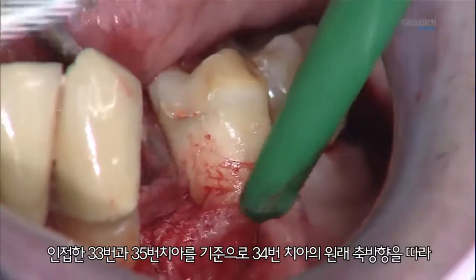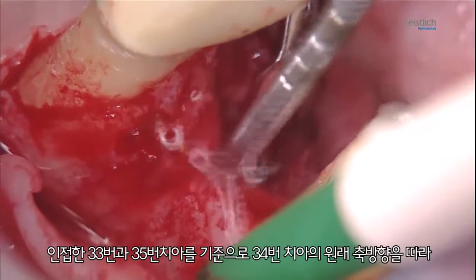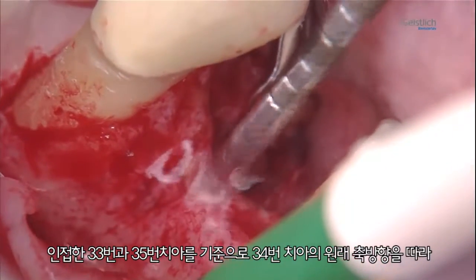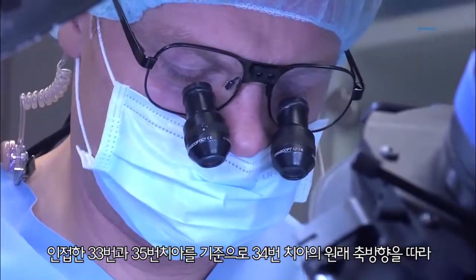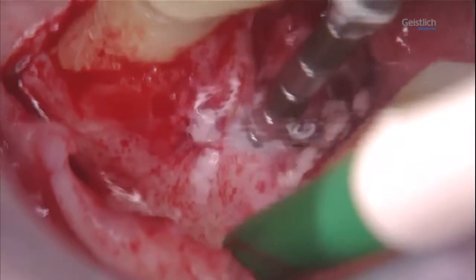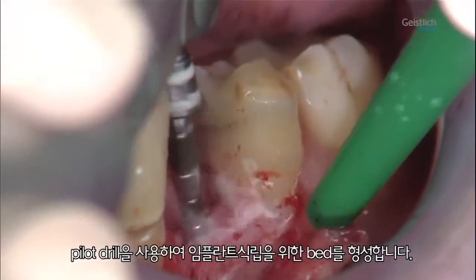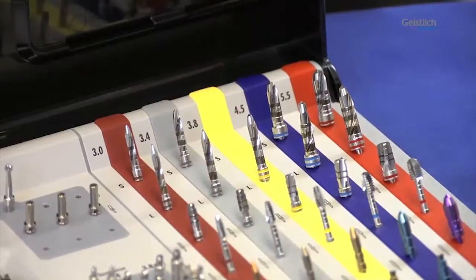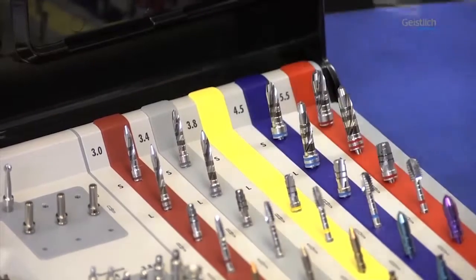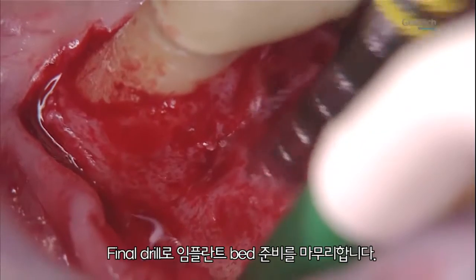We prepare the implant bed with a pilot drill under irrigation, following the axial direction of the original tooth 3-4, with the adjacent teeth 3-3 and 3-5 providing additional guidance. The pilot hole is now complete. We finalize the implant bed with a concluding round of irrigated drilling.